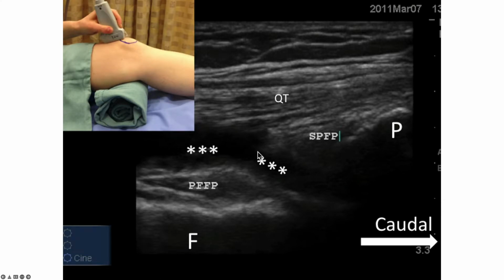Now, the space I just showed you is more physiological. Yes, in between the two fat pads, usually you see some fluid. But when you see fluid that actually extends even over the prefemoral fat pad, that means the patient has an effusion.